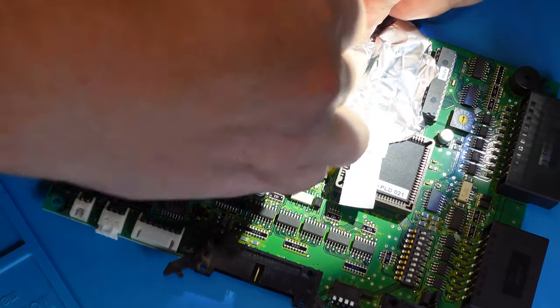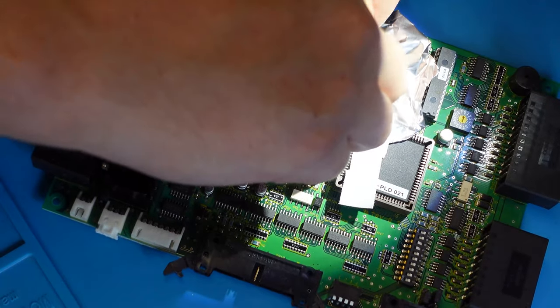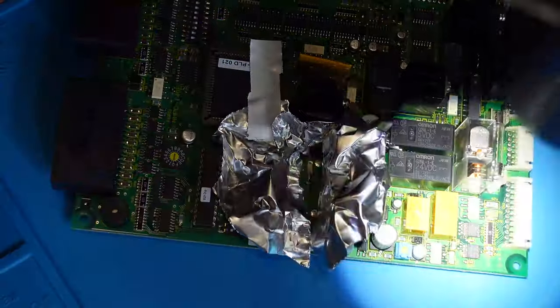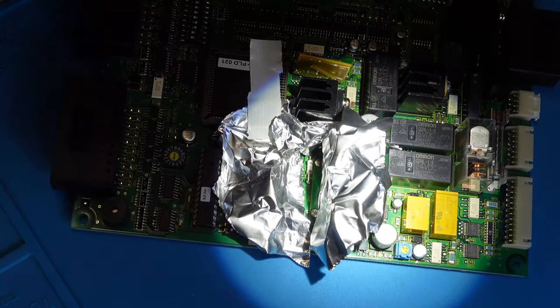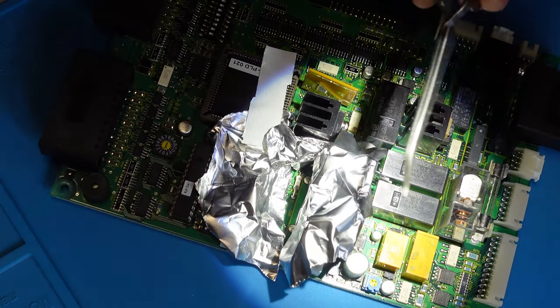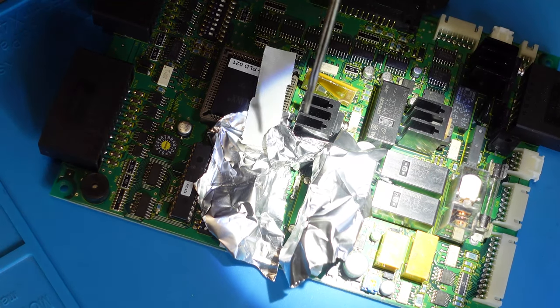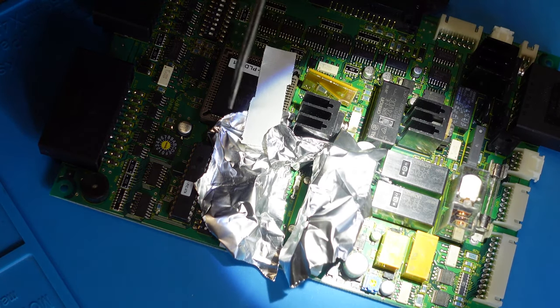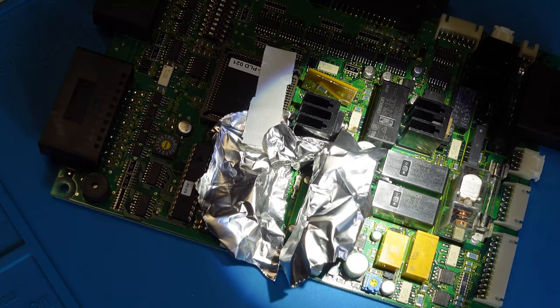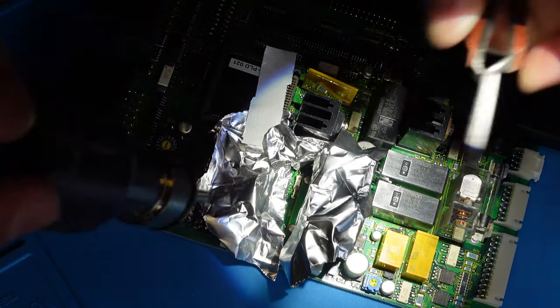And over that guy. This that I'm going to be removing is the fuse, which is right there. Now that I have this guy exposed, I've got a pair of my reverse-closing tweezers. I could do this one of two ways. I think I'm going to do this with the hot air gun. Let's see how well I can get this.